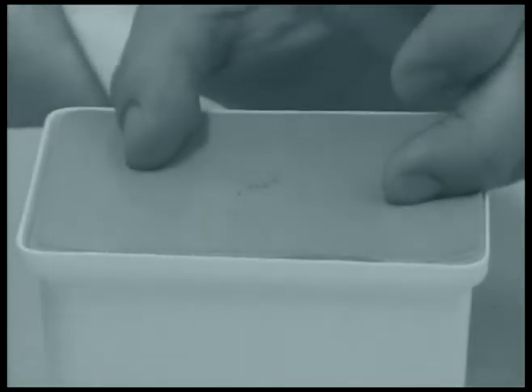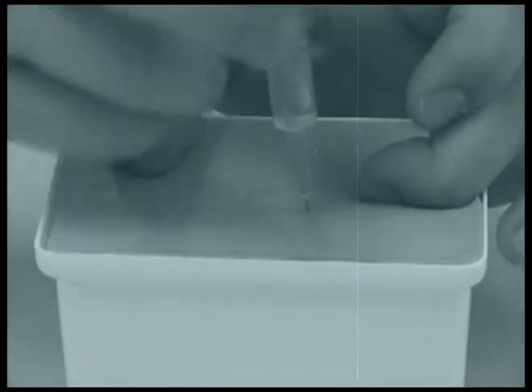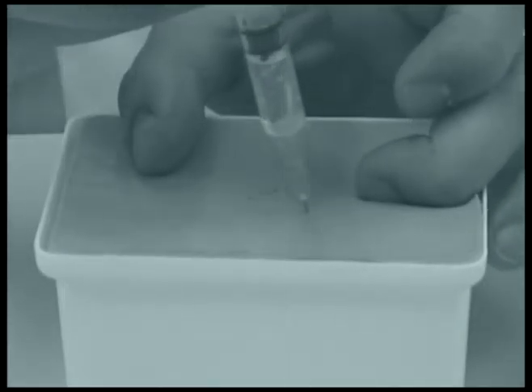After cleansing the site and allowing it to dry, stretch the skin around the area and plant the needle at 90 degrees, two-thirds of the way in. Draw back the syringe. If no blood is aspirated, depress the plunger and inject the drug slowly and smoothly.